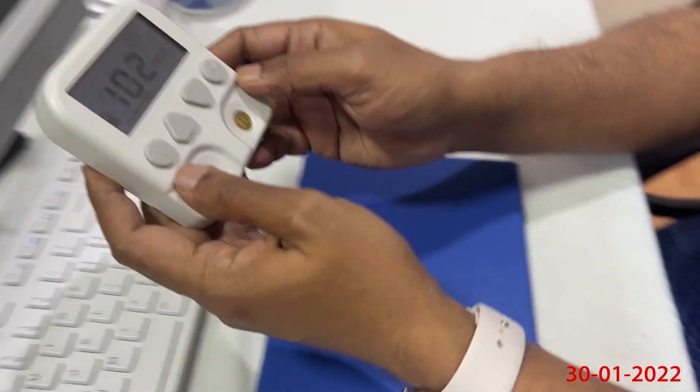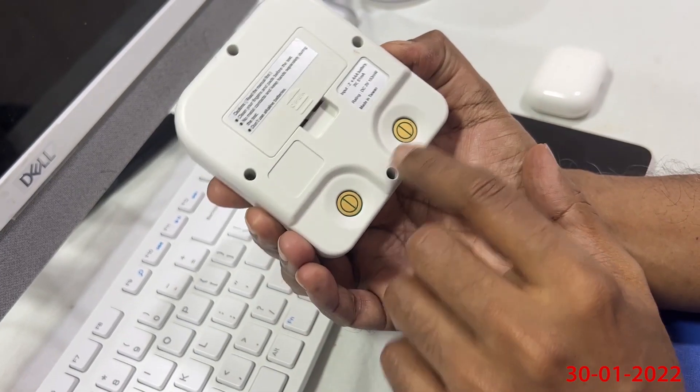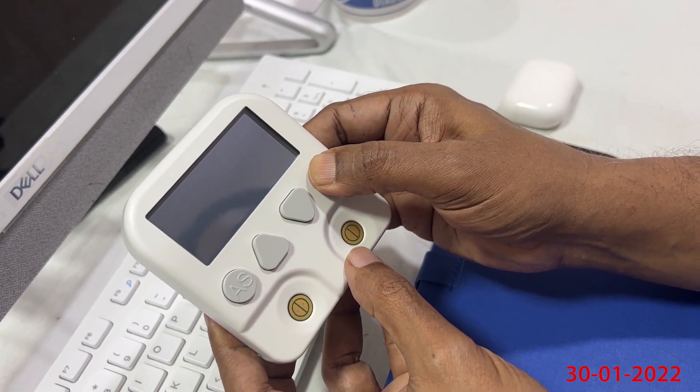It is not working on my iPhone, but it is working on the Android phone. You can see that the device has four sensors — two sensors at the back and two sensors in the front of the device.